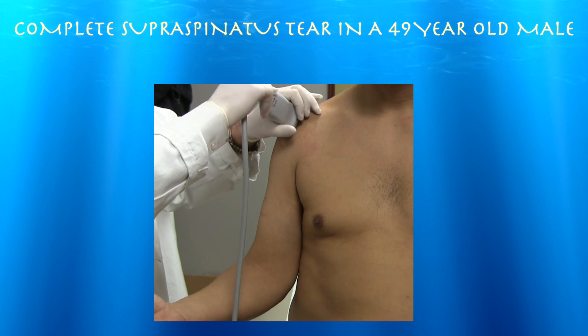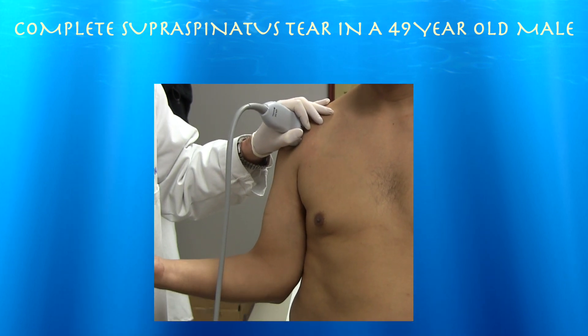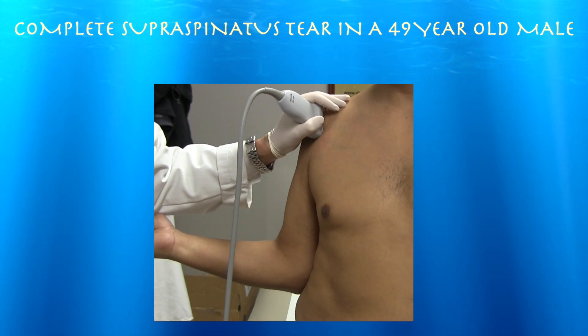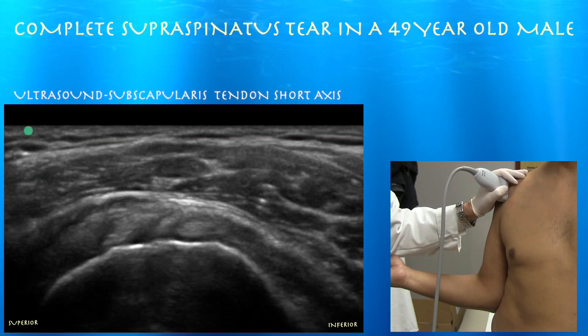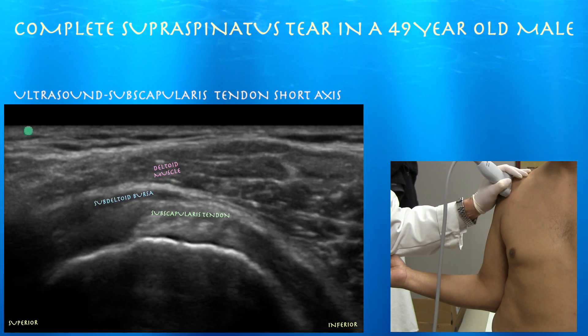I'm just going to go ahead and do a quick short-axis view of it. Here's our short-axis view — it's fairly preserved. Again, intact subscapularis tendon. You can see a little bit of subdeltoid bursitis as well.